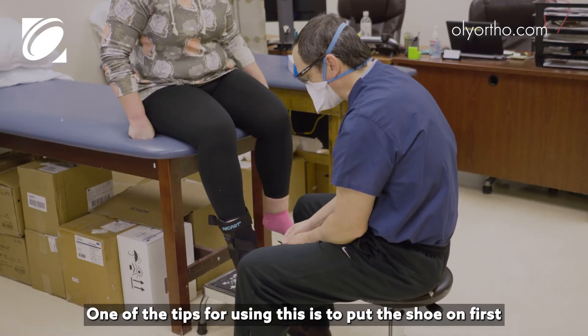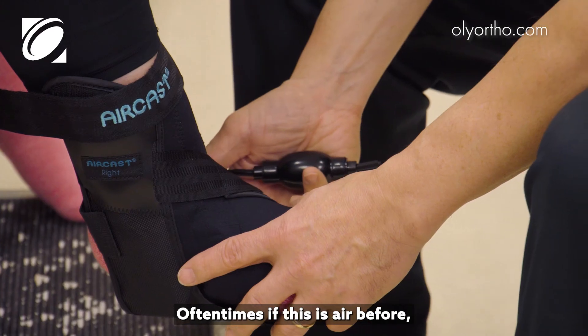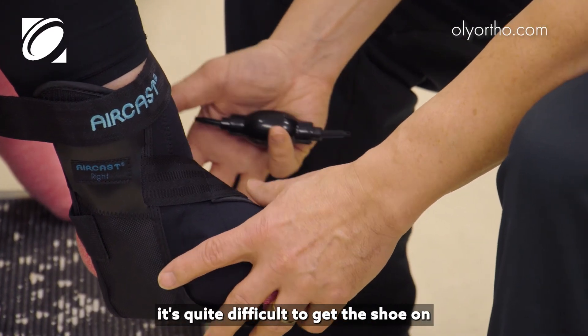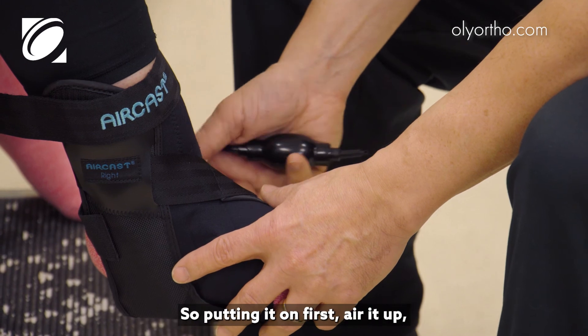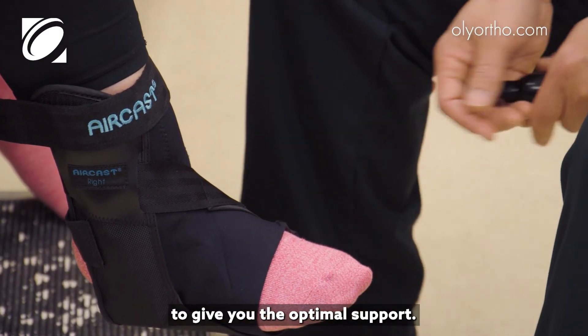One of the tips for using this is to put the shoe on first and then air it up. Oftentimes if this is aired before, it's quite difficult to get the shoe on, and different shoes fit differently. So putting it on first and then airing it up ensures you can get a perfect fit for optimal support.